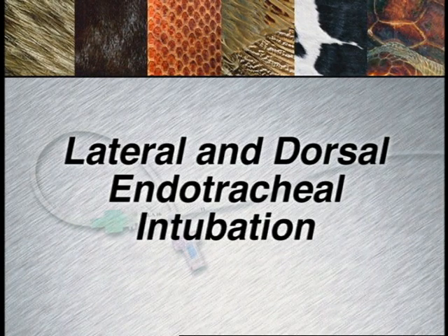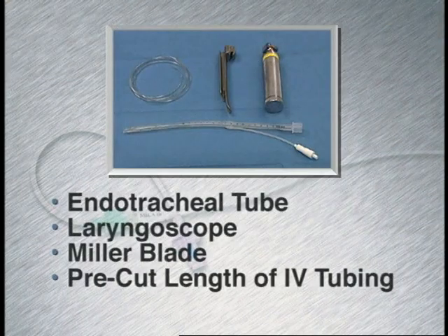Lateral and dorsal endotracheal intubation, as indicated in critical patients, can be done by one individual. Dorsal intubation allows for placement of a tube one size larger than normal.